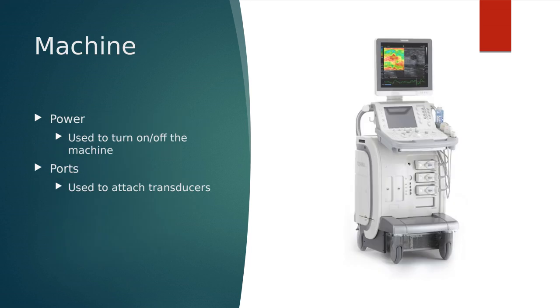So here's our standard machine. We know that we have a power button, which turns it on and off, and we can see our ports located right in the front here.